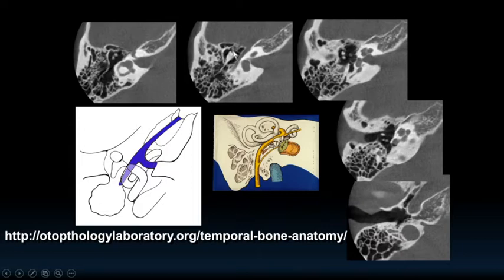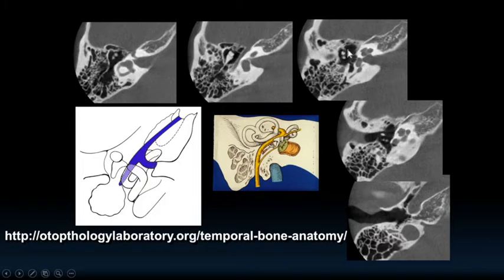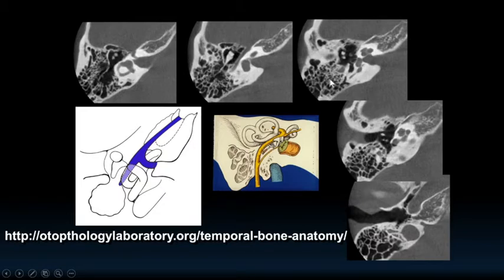The five key axial index images are: the level of the lateral canal, the IAC with the facial nerve, then the tympanic segment of the facial nerve — labyrinthine segment, then genu, then tympanic segment — then the oval window level showing extensive cochlear anatomy, and dropping down to the round window. Once you know these five images, you can find your way up and down and name all the structures that come into view.